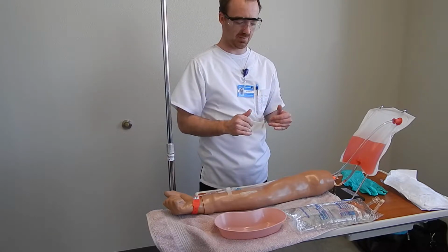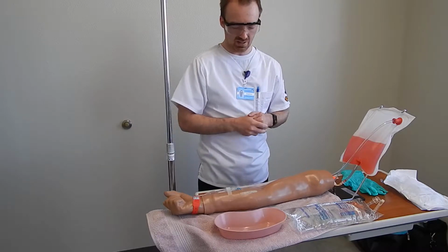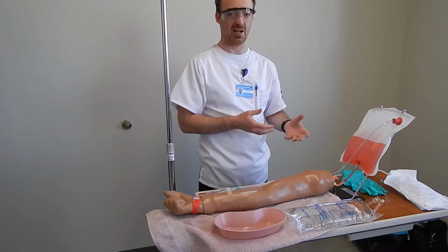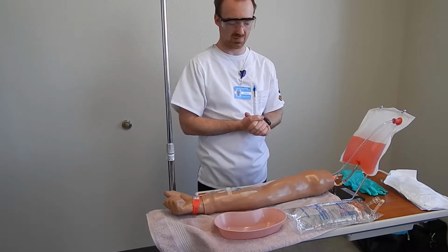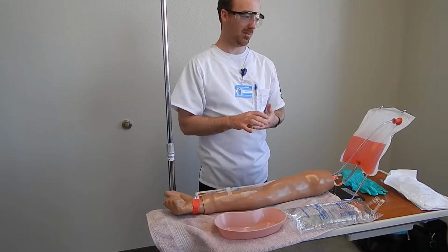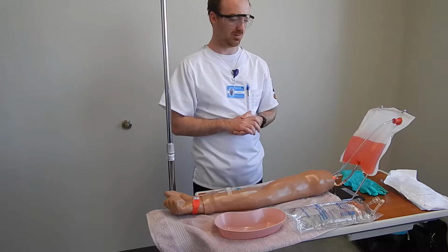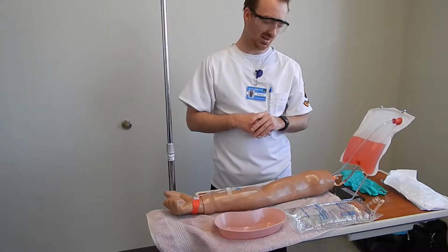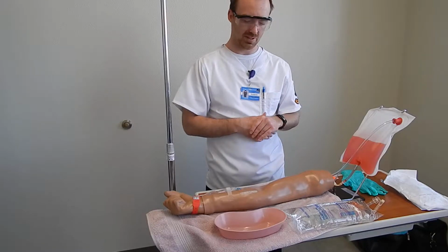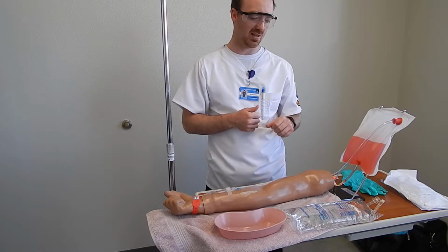We would do our med calculation for this. This is the potassium chloride. We talk to the patient about any allergic reactions or anything of that. Patient denies any problems with potassium chloride in the past. So we'll go ahead and explain the procedure and the need for the potassium chloride. The doctor's ordered it, patient agrees to it.